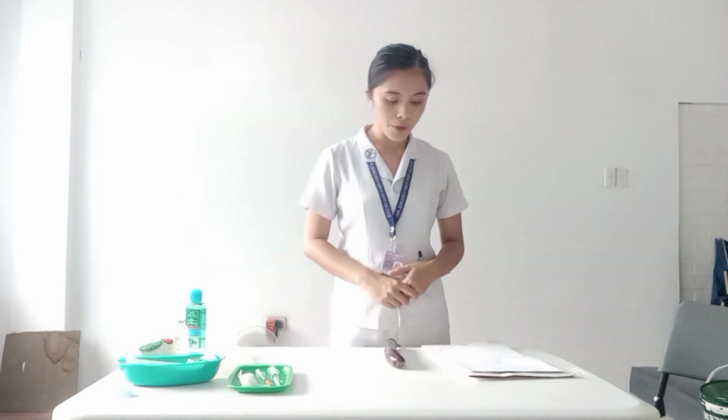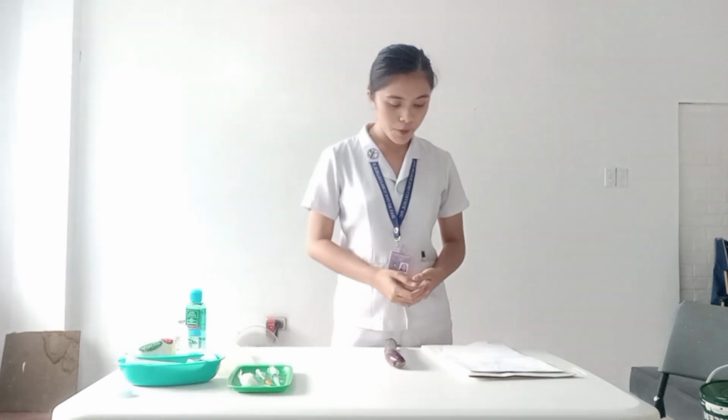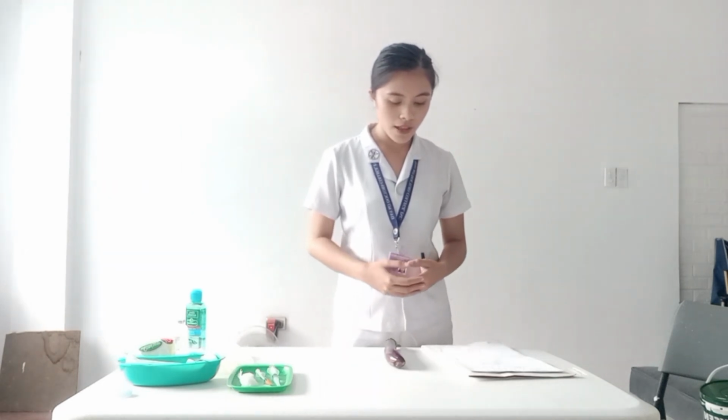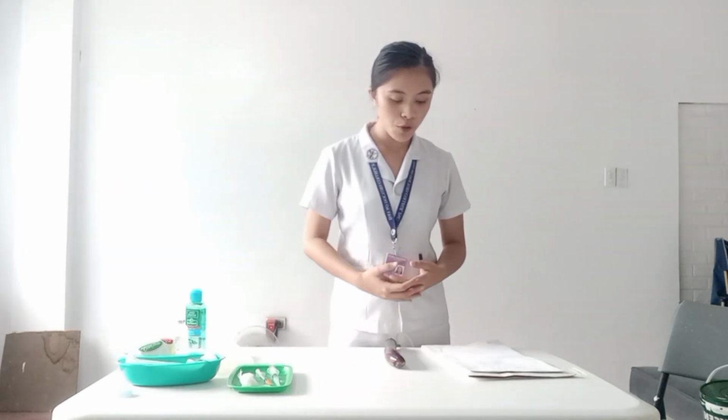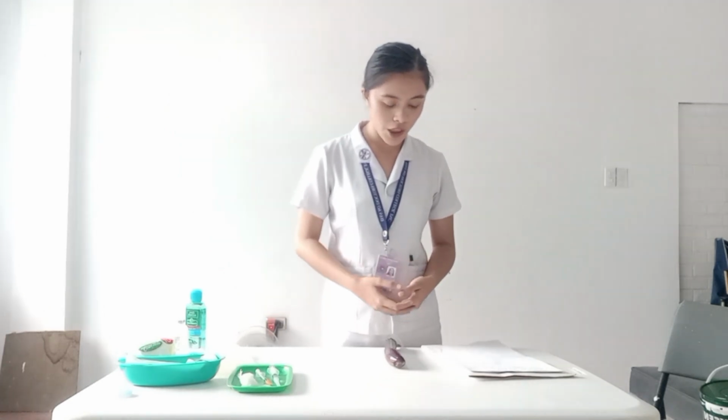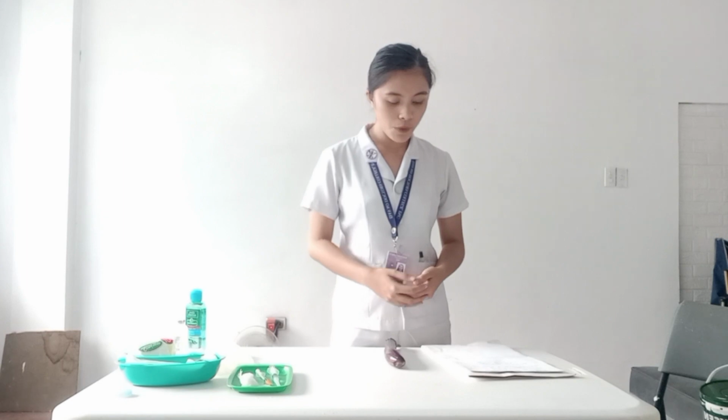Okay, thank you. So, ma'am, your doctor prescribed you a cortisone. So it is an anti-inflammatory, which will help you with your tendinitis. So I will be injecting this medication to your shoulder. Will that be alright with you, ma'am? So after that, assist the client to a position depending on the chosen site.